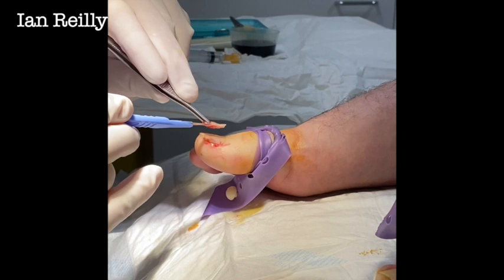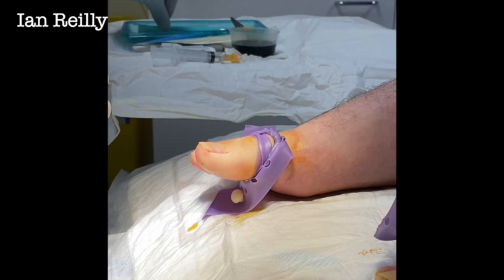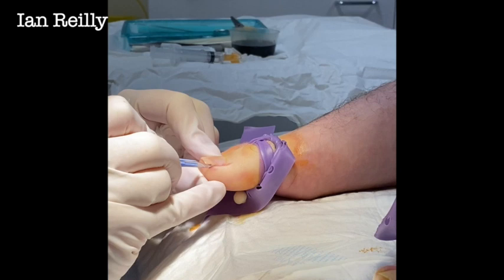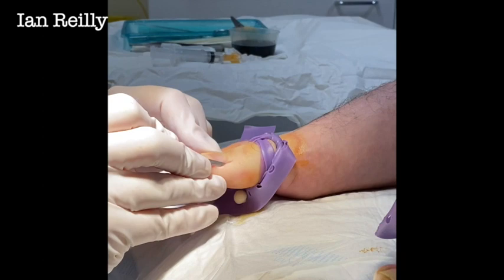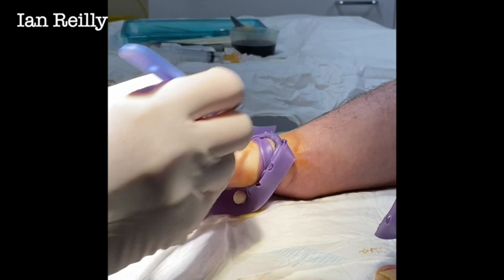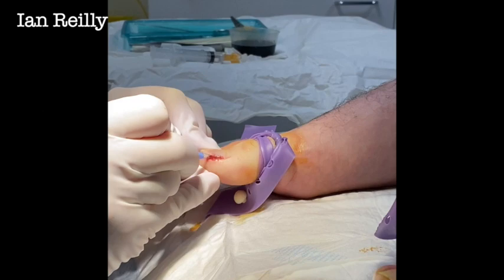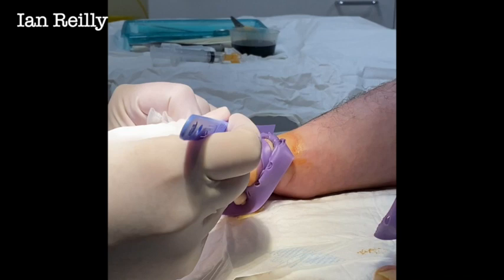So that's just that little section of skin we've just taken out there. I said I'd look at the nail and just check that's all okay — yes, the nail looks nice. Just a tiny little bit of irregularity down there, so we're going to just slightly address that. But effectively it's the skin that's the trouble. It's almost like it's a bit of scar tissue down the side, which is why it's a bit thick.